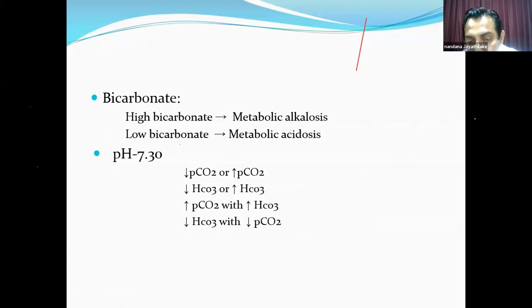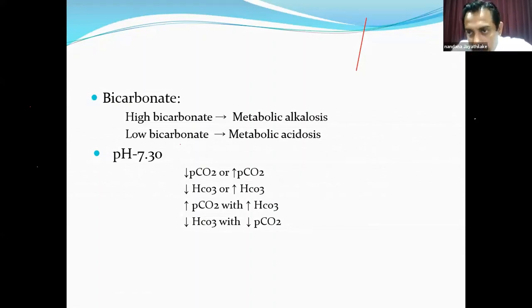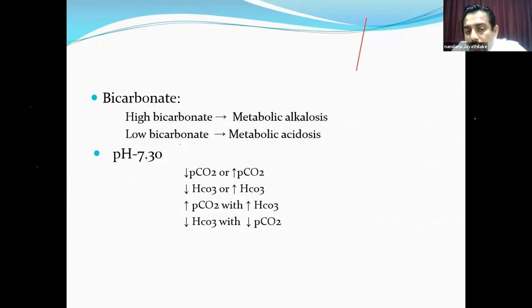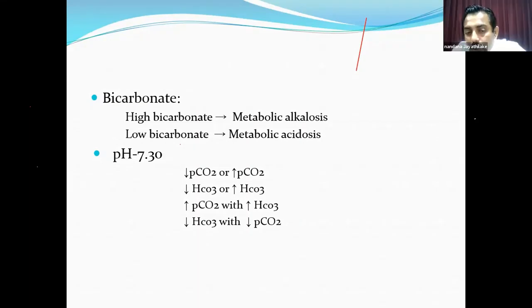Can it be increased PCO2 with increased bicarbonate? Yes, it can, because according to the formula which I have given before, the increased bicarbonate should not be the primary cause for this pH, but it is the secondary cause. The primary problem is increased PCO2.